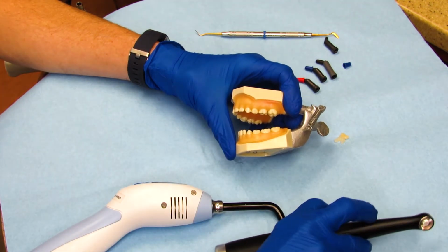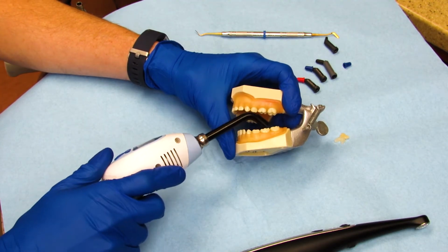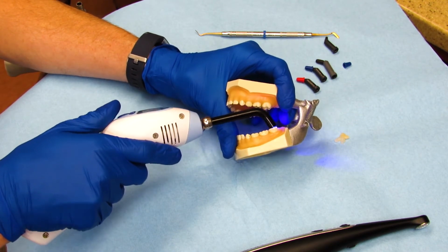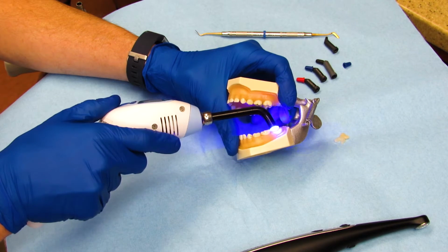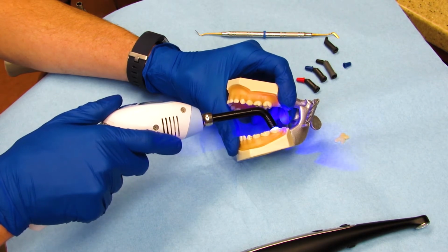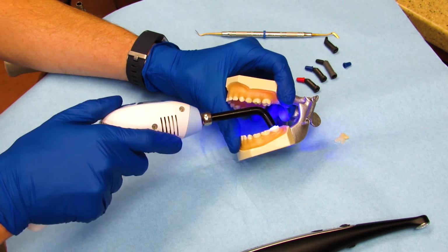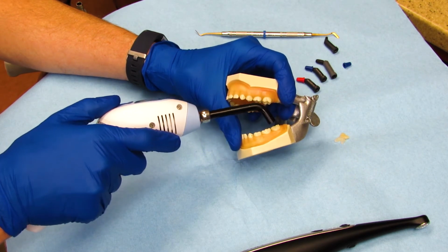And that's pretty comfortable. Whereas if I have to use this other curing light, I have to have you open your mouth much wider, and that's a much bigger distance to cure. And it's just more uncomfortable when you're having to wait for that. And you add the 10 seconds, it's not as much fun.